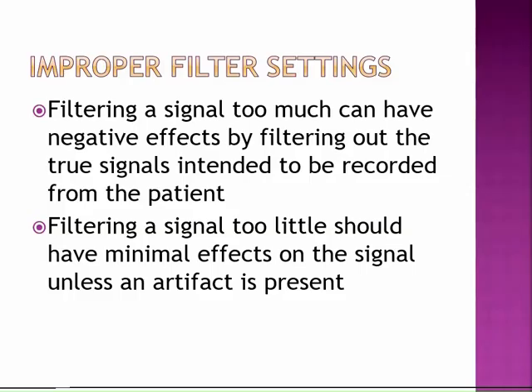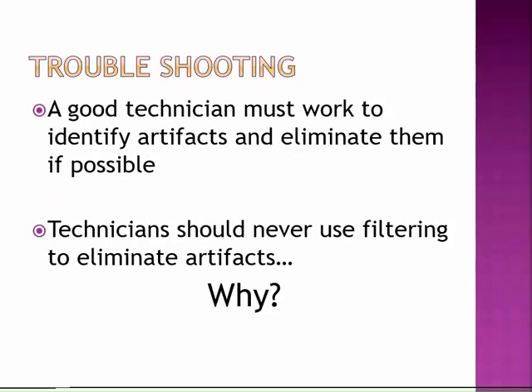By not filtering a channel, it shouldn't have an impact on the signals coming through, because as long as you did a quality hookup to begin with, your signals will be pretty clean. Filters are there if we need them, but they really are more of a last resort. So you need to start working on identifying artifacts and on how to eliminate them.